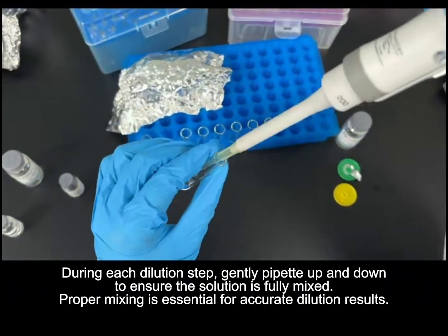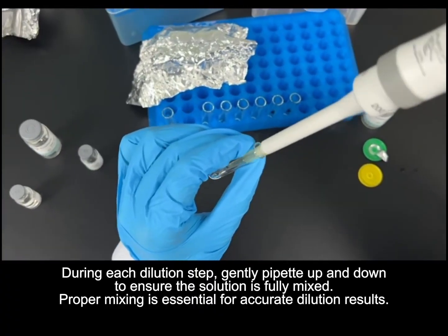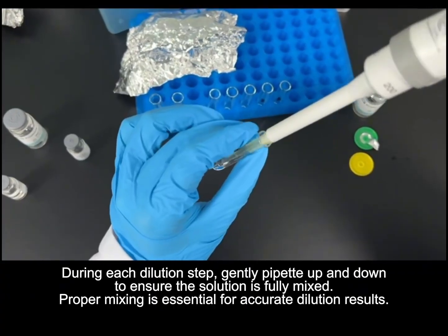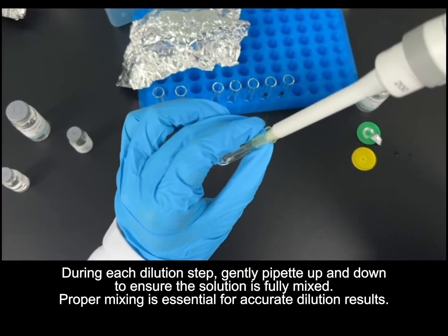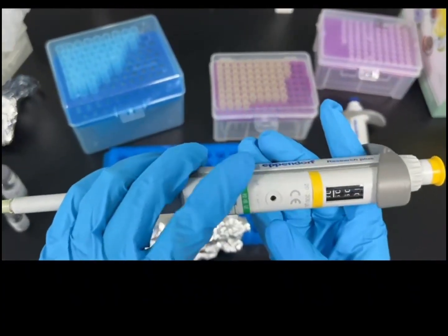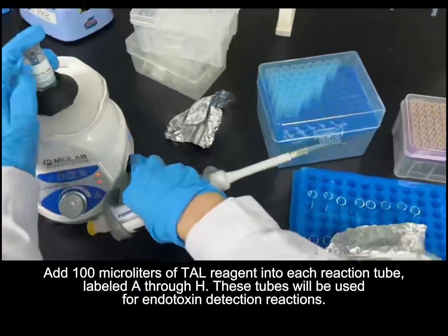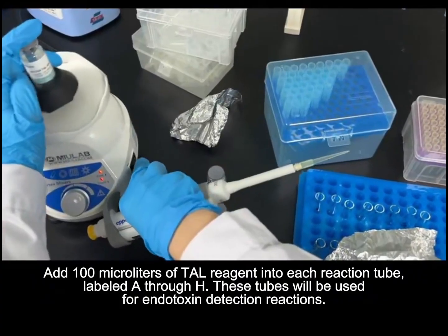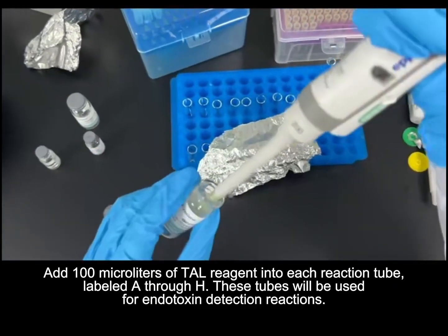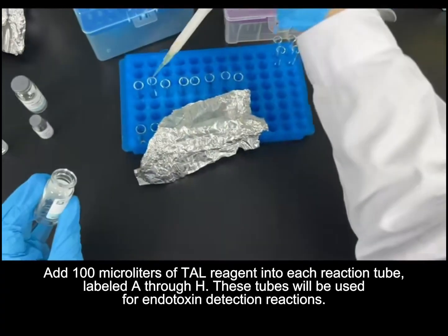Add 100 microliters of TAL reagent into each reaction tube, labeled A through H. These tubes will be used for endotoxin detection reactions. Next, add 100 microliters of each CSE dilution into the corresponding reaction tubes. These tubes represent the experimental group.